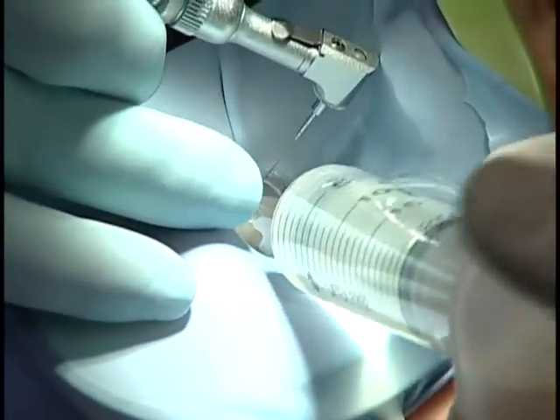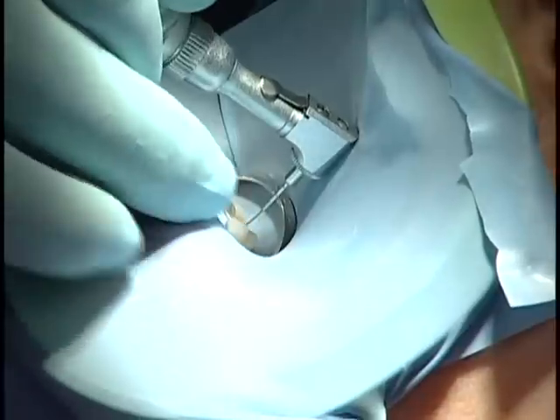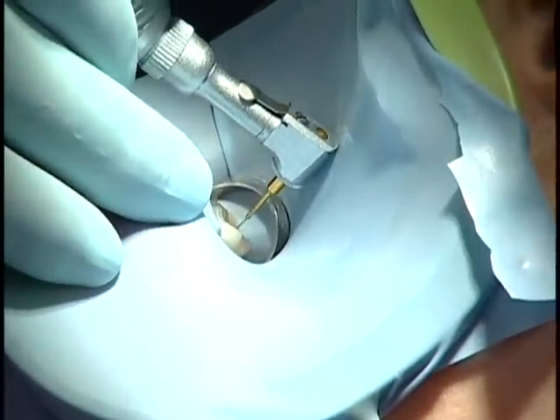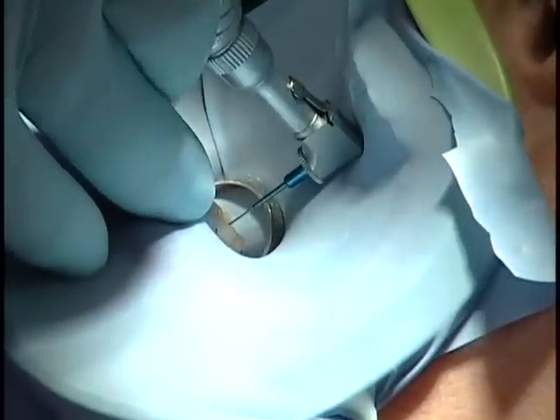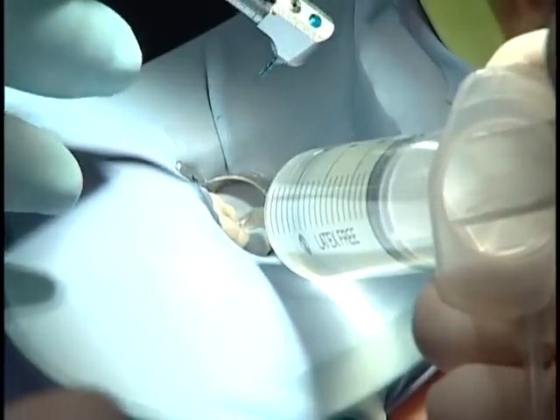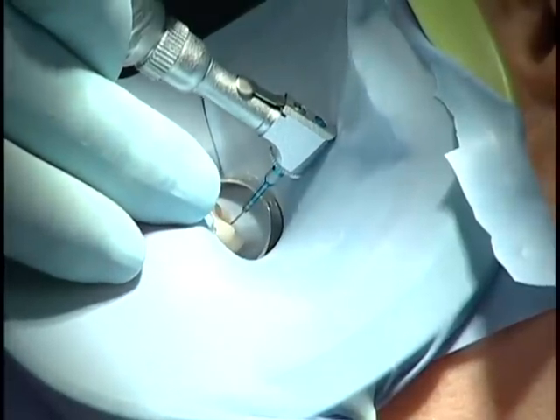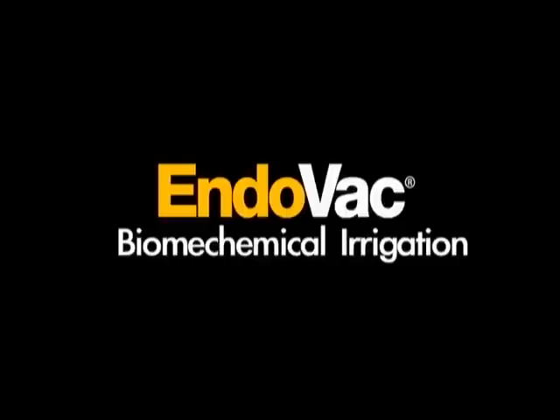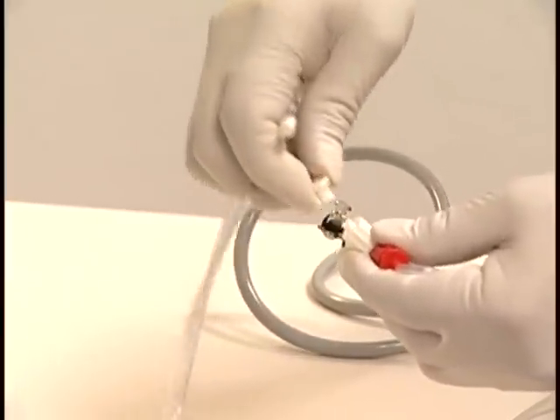Jennifer will also use the master delivery tip to deliver irrigants during all canal instrumentation as well. When all instrumentation is completed, they'll begin biochemical irrigation down deep in the canal. Jennifer, we'll need the Endovac handpiece now with the blue macro cannula.